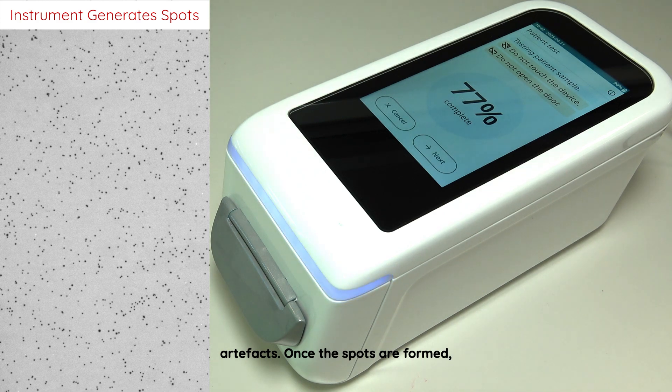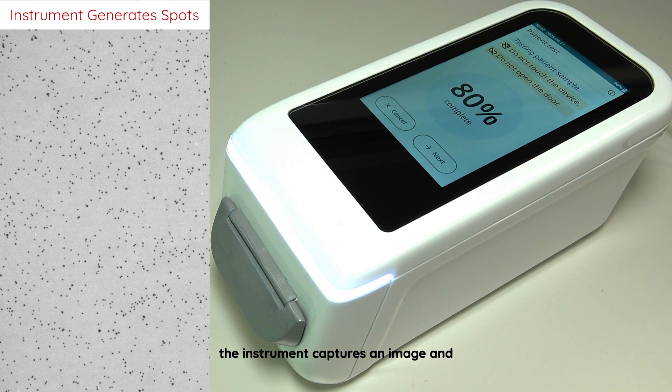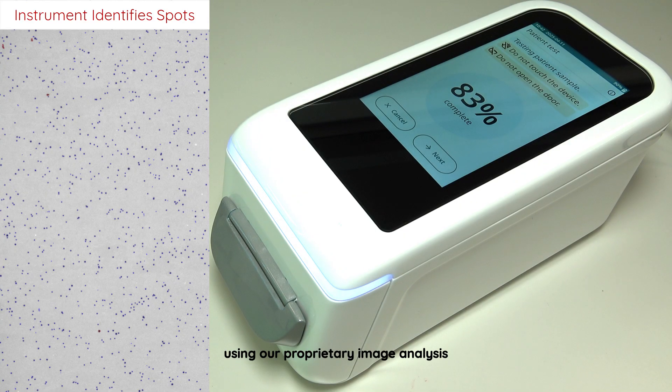Once the spots are formed, the instrument captures an image and, using our proprietary image analysis algorithm, simply counts the spots and then calculates the concentration of the troponin, which is displayed on the touchscreen.